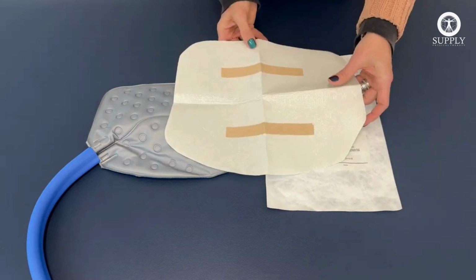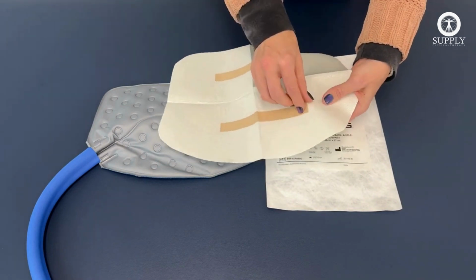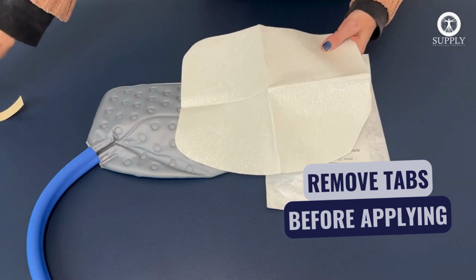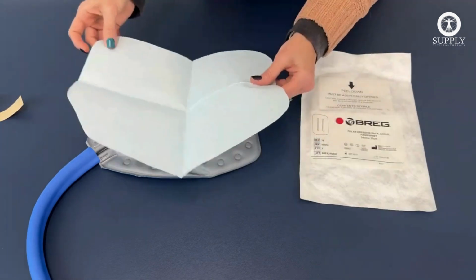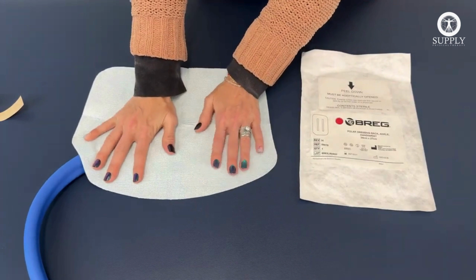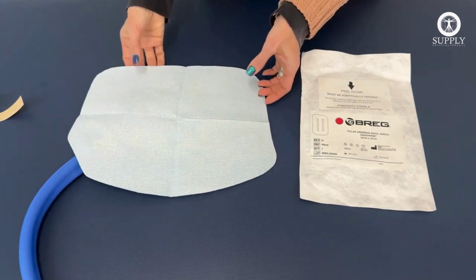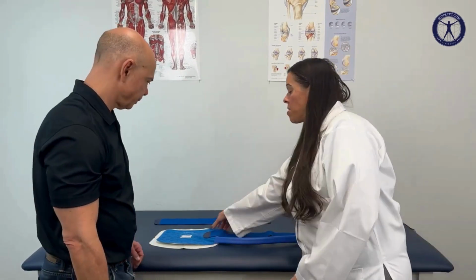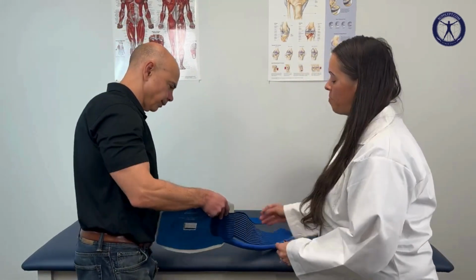You're going to open it up, and you're going to see 2 tabs, which you will want to remove so that you can stick it inside the pad. Once they're removed, place the dressing down firmly into the pad, and then you are ready to apply it to your body part. As you can see, our sterile dressing is already in place.